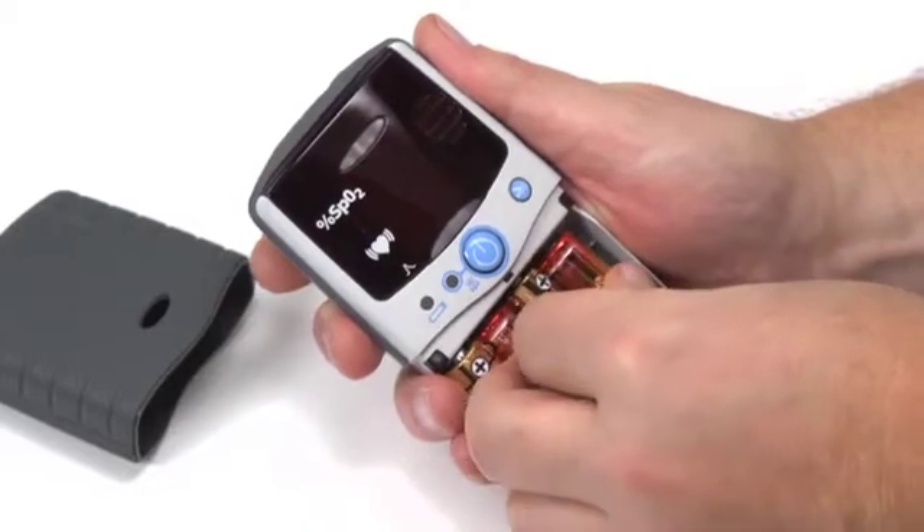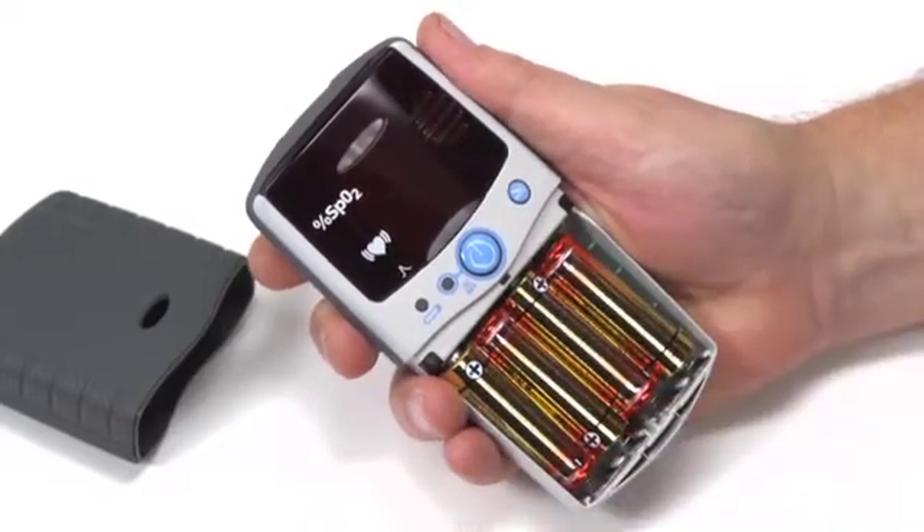Remember, replace the batteries within 30 seconds to retain the clock, date, and alarm settings.